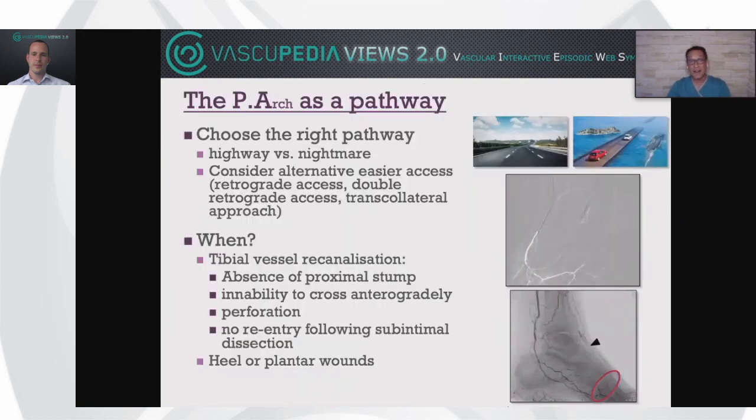And if you use the plantar arch as a pathway, my first step would be to choose the right pathway, because you want to transit in a nice, smooth, and easy highway rather than get entrapped in a complex hash, sort of nightmare. And if you get entrapped in this situation, I would definitely consider an easier alternative access, such as a retrograde access, even a double retrograde access, or a transcollateral approach.